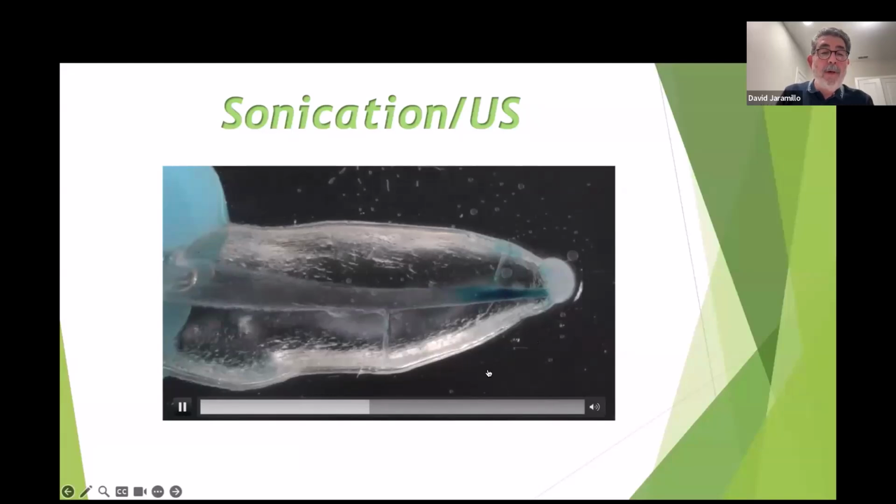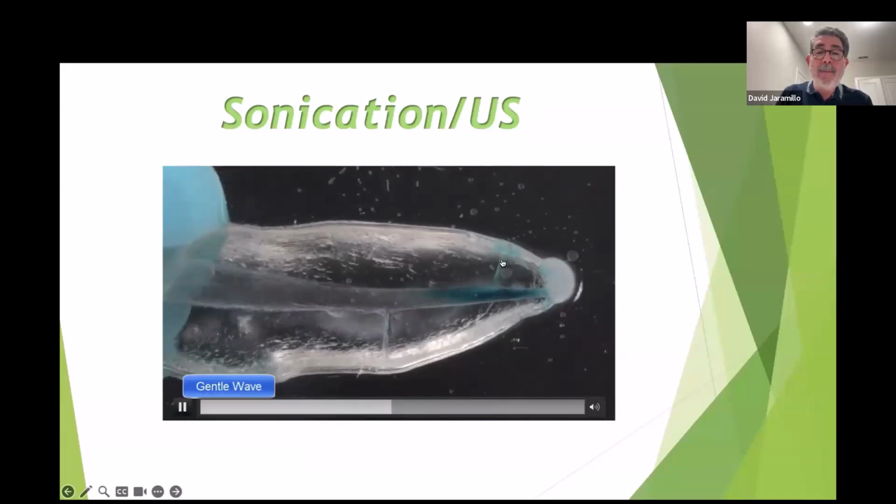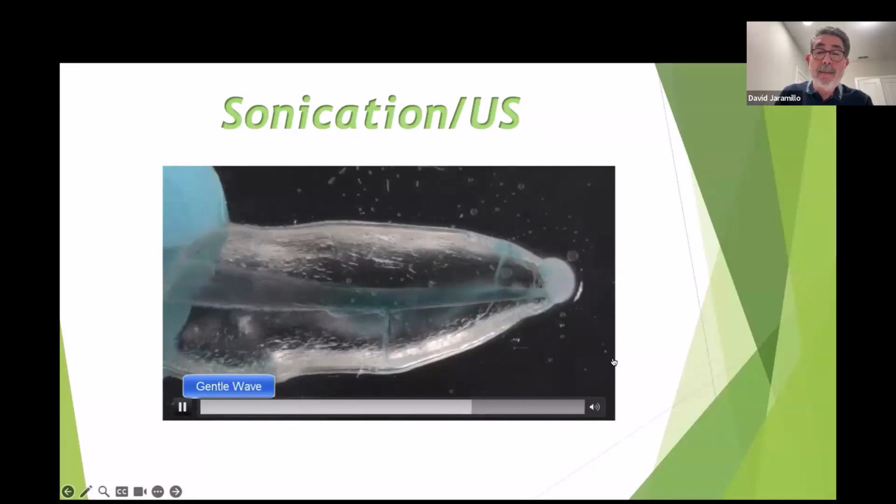So we connect the GentleWave, and as soon as we connect the GentleWave, we can see the activity in these lateral canals, right? The bubbles that are inside the root canal are going to be little by little dislodged by the degas solution, but we can see how fast this works, especially in these lateral canals.